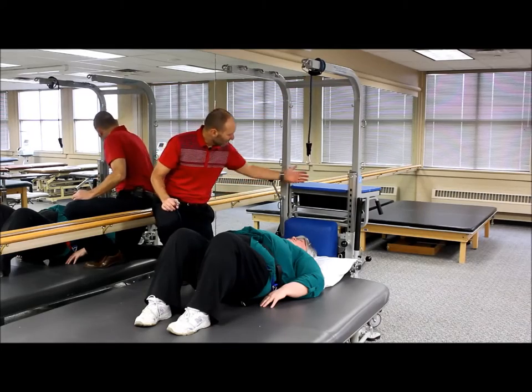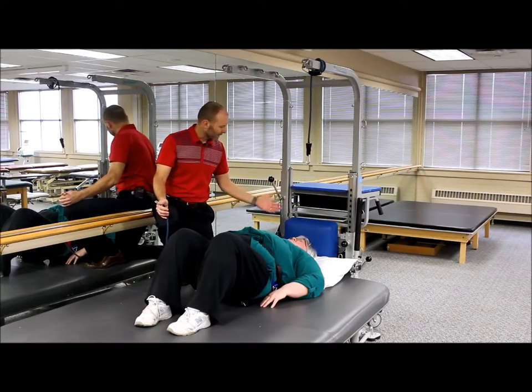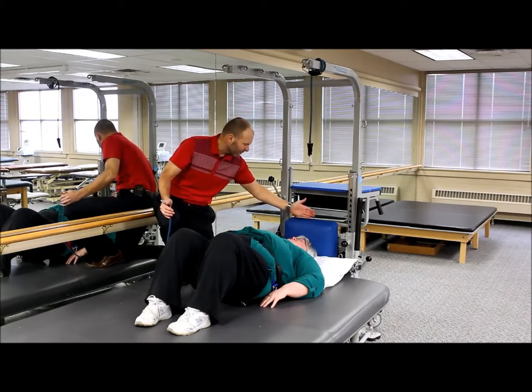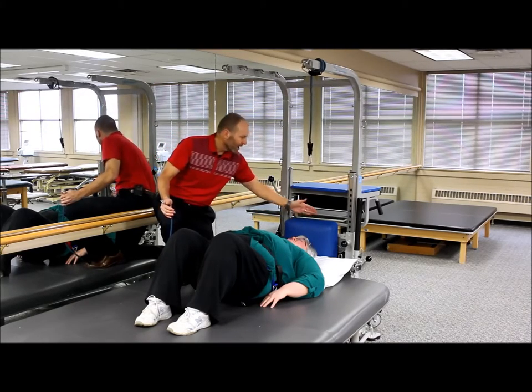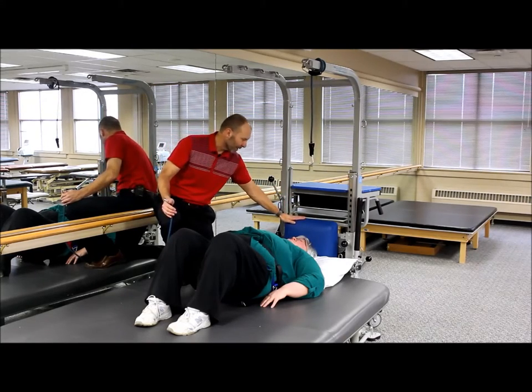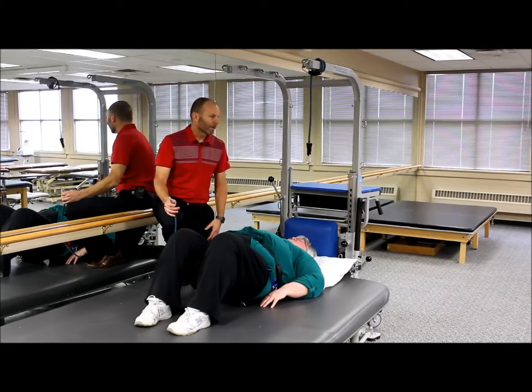What we've done here is we've got our mat table that we've been able to slide the legs of the rehab station underneath. We've got the pad here positioned at the person's head so that as they're doing the bridging, they can't slide up — this will stop them from sliding up. We've got a pillow there for comfort as well.